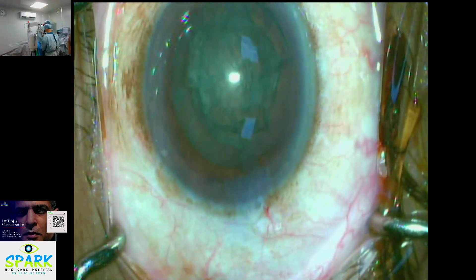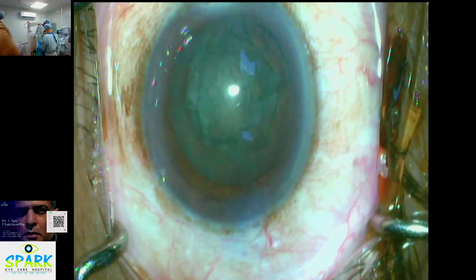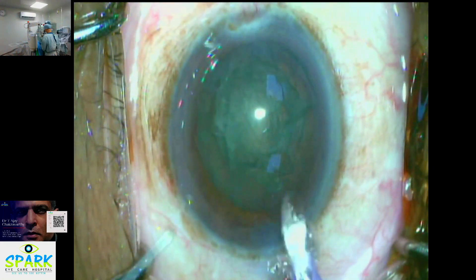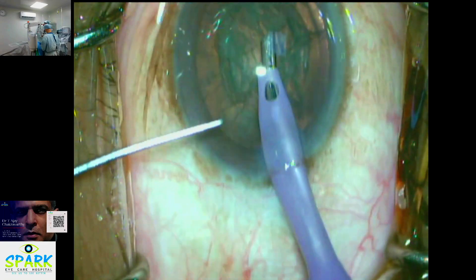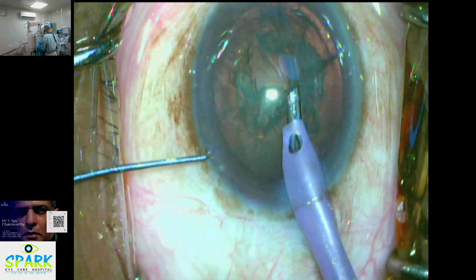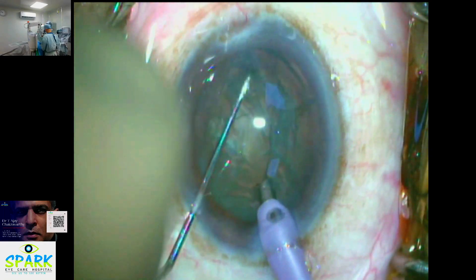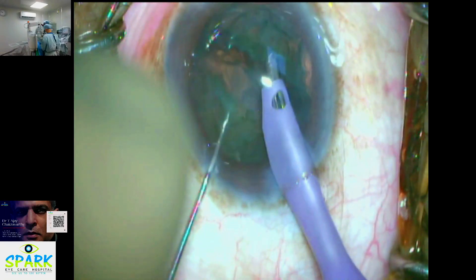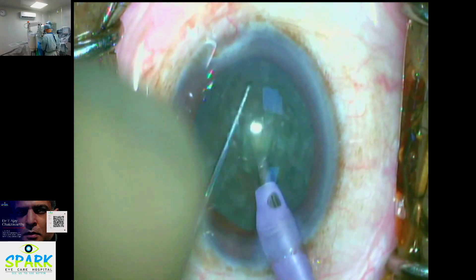Now the cataract has become visible. Next, I am going to take the FACO probe. This is the second instrument, and now I am going to use the second instrument.